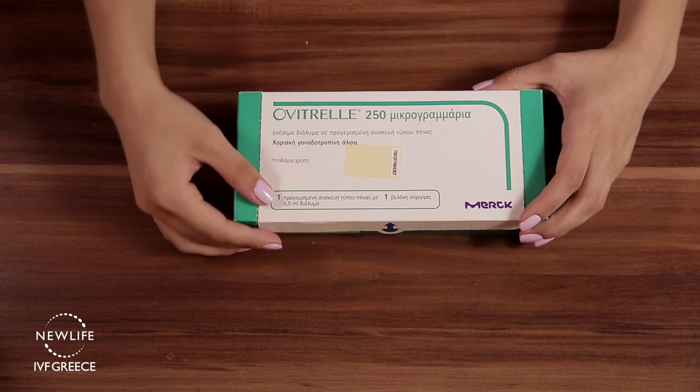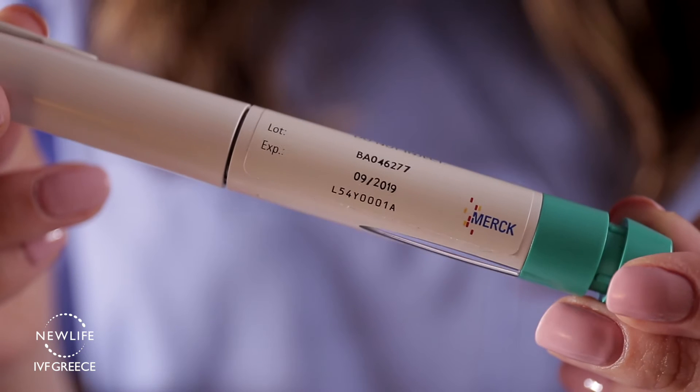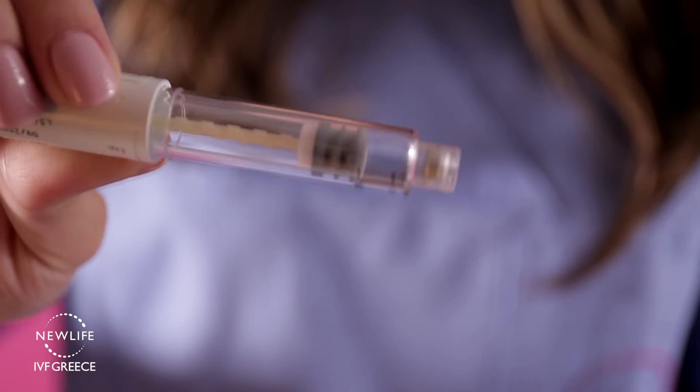Inside the box you will find one pre-filled pen and one small needle. Always check the expiration date of your medication before use, and also check that the medication fluid is clear and transparent.